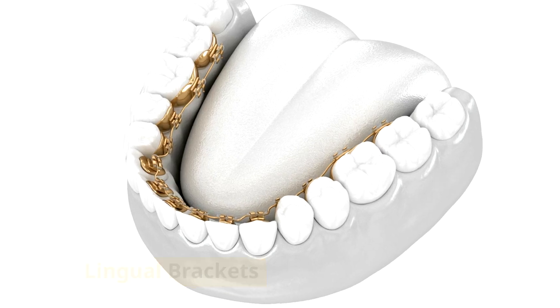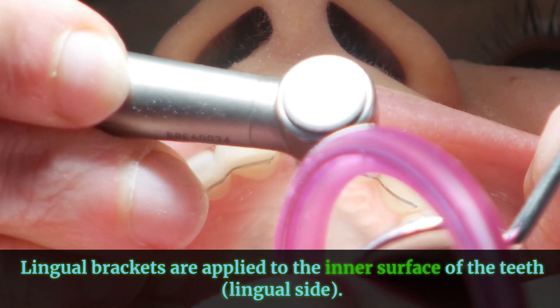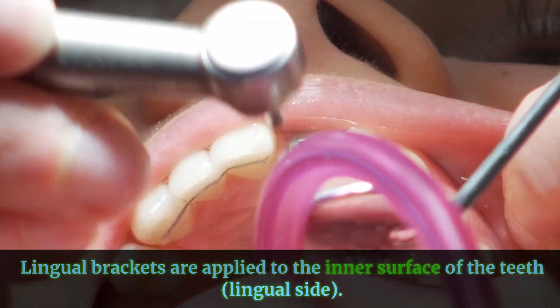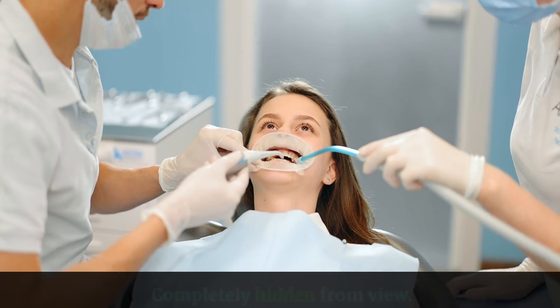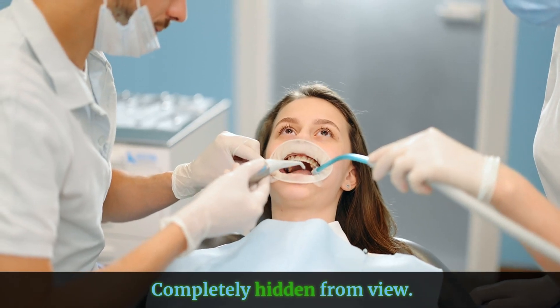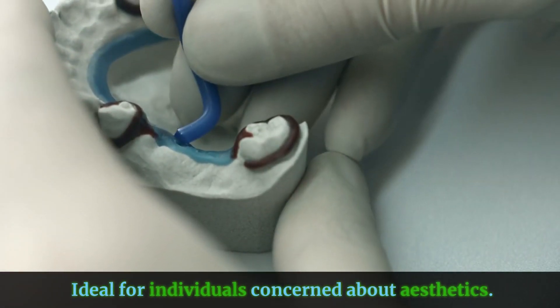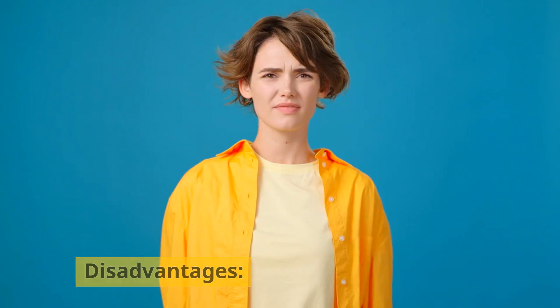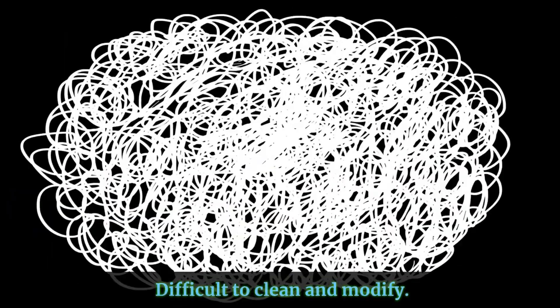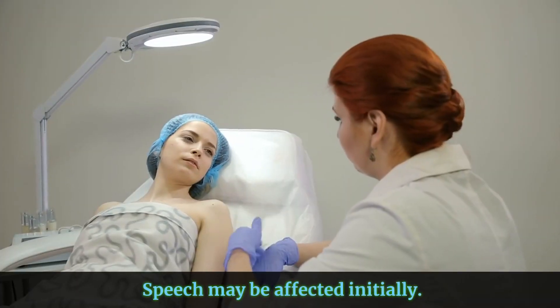Lingual brackets are applied to the inner, lingual surface of the teeth. Advantages: completely hidden from view and ideal for individuals concerned about aesthetics. Disadvantages: difficult to clean and modify, and speech may be affected initially.